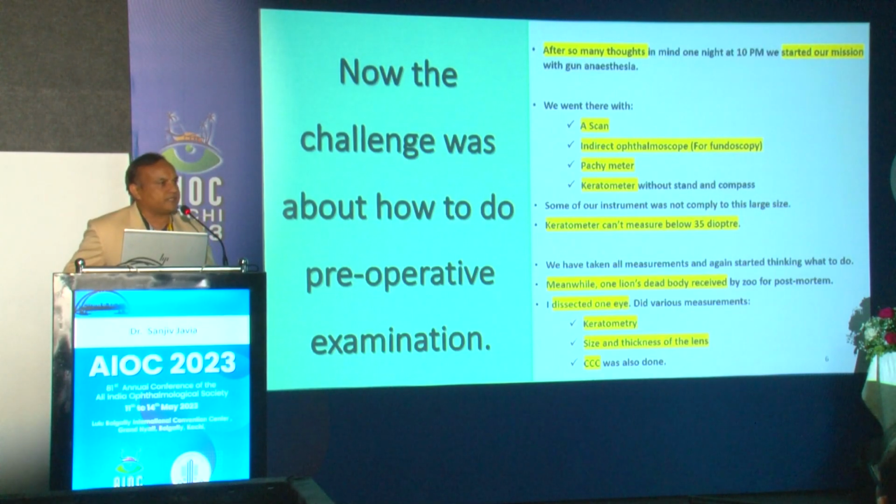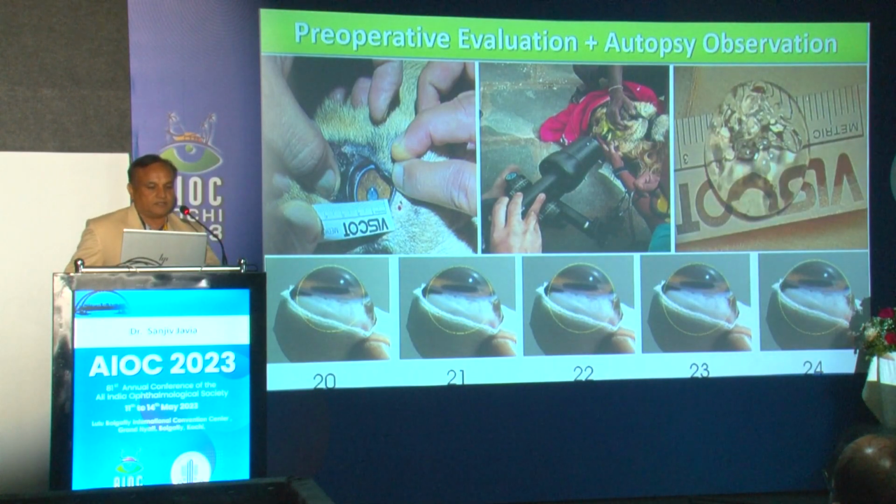After the permission of the forest department, I told them to transfer him to the nearest zoo, where hospitals are available in Junagadh city. We examined at night time. After 1 month of first detection, we started examining at night. With a gun tranquilizer, we tranquilized the patient. A-scan, pachymeter, keratometry, all were done. Although we were in a dilemma, meantime, these are the photographs that we took at that time.